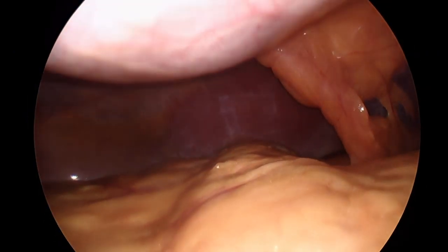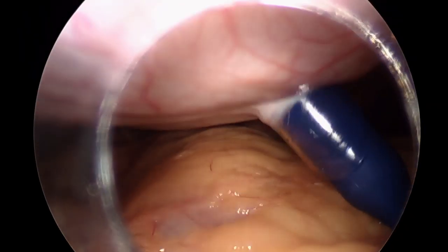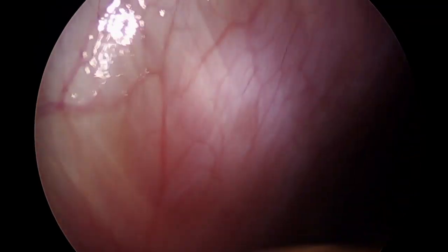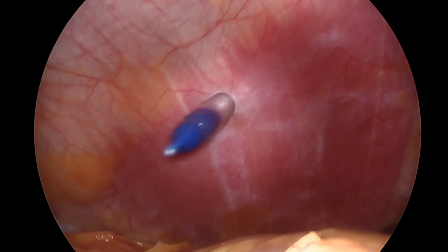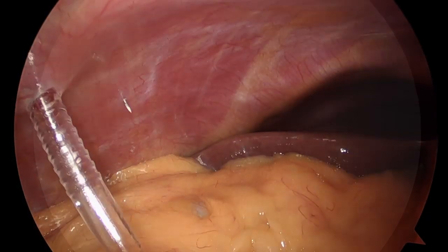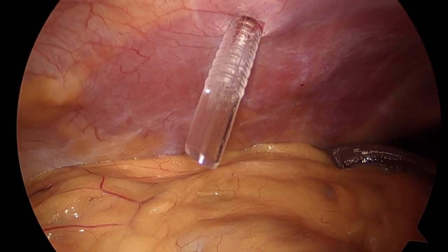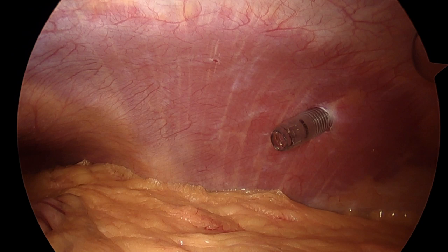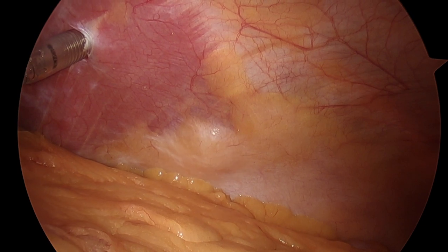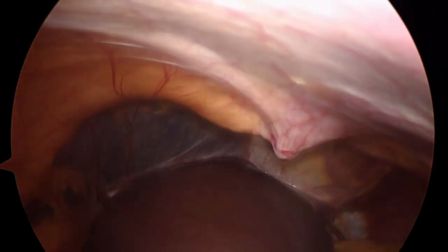After confirming no injury during Veress needle or trocar insertion, we proceed with placing our remaining ports under direct visualization, including a 12 mm left periumbilical port for the laparoscope, a 5 mm right subcostal trocar approximately two finger breadths below the liver edge, and a 15 mm port in the right hemiabdomen between the right subcostal port and the umbilicus. It is important not to place the 15 mm port too cephalad, as this will make articulation of the first staple fire difficult due to proximity to the gastric antrum. We routinely perform a bilateral TAP block in four quadrants using diluted liposomal bupivacaine, injected into the plane between the internal oblique and transversus abdominis muscle layers for regional postoperative pain control.